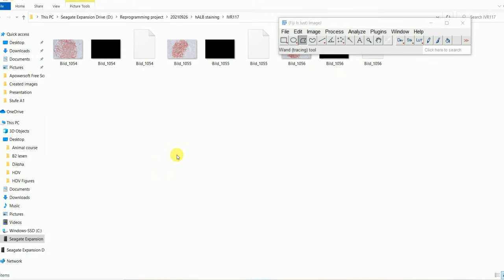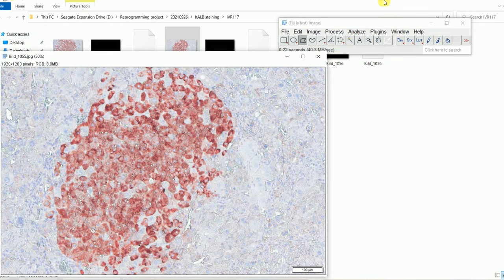Okay, so first, to quantify the images, we just have to go to the image. Let's say that this is the image that I want to quantify, and I'm just going to drag and drop it in the ImageJ software. I already have the program opened on my computer. So this is my image that I want to quantify, right? This is the positive area, and these are the negative areas. So this is the area that I want to quantify.